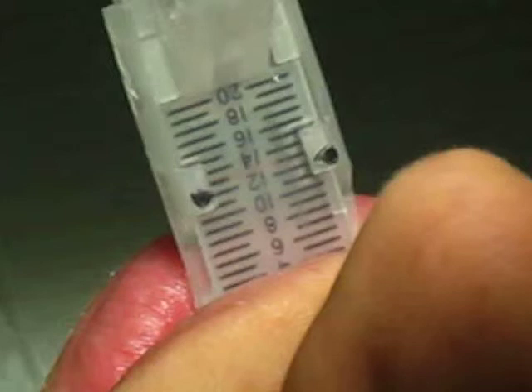The first scale reading is the patient's habitual bite position. With the trays in place, ask the patient to establish their most comfortable bite position. In this case, the patient's habitual bite position is 13.